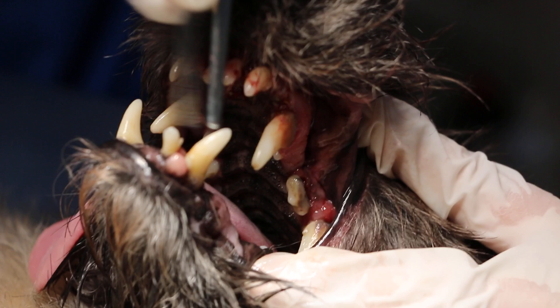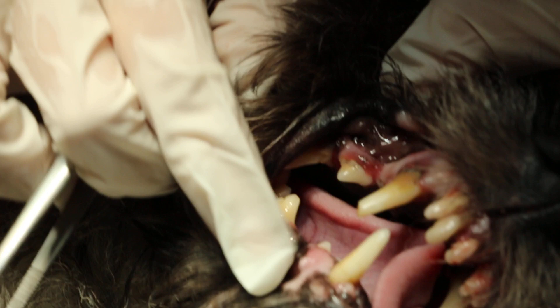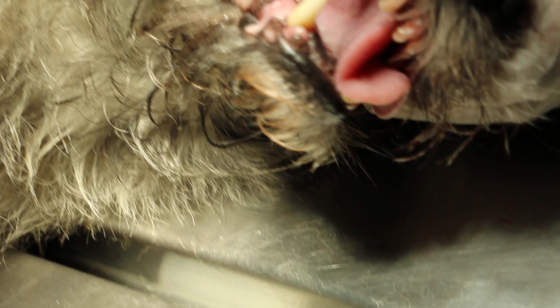So we check carefully — is there another one? No more. We check carefully — is there one more here? No. So now we will remove the fourth one.